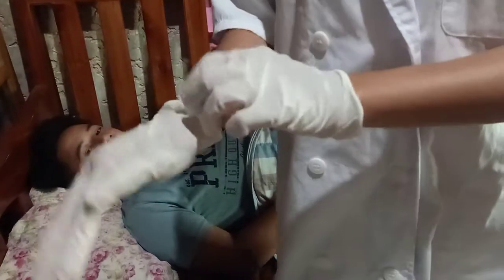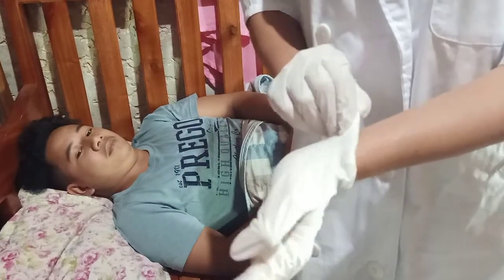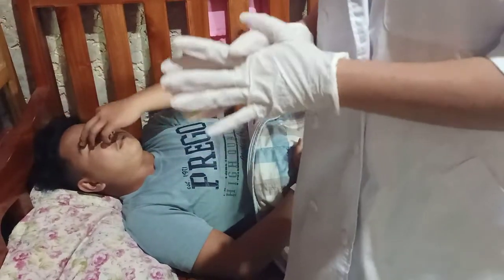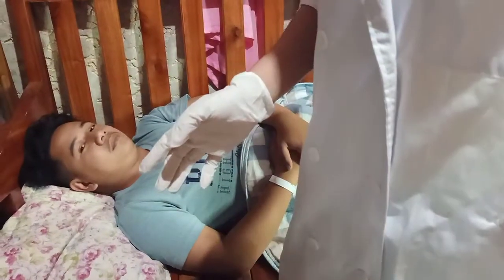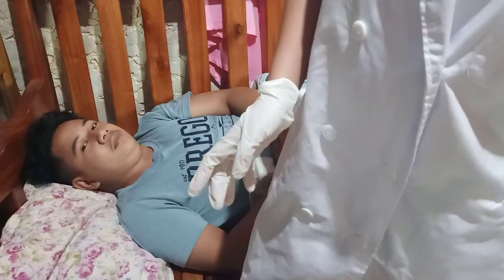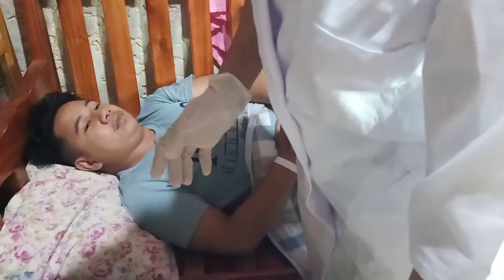Now, use an antiseptic swab to clean the site, beginning at the center and moving outward in a 5 centimeter area. And now remove the cap.